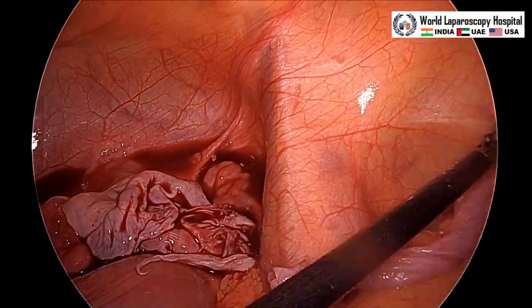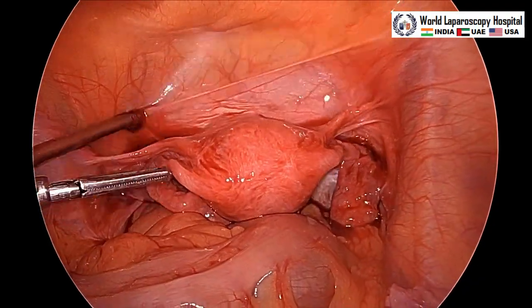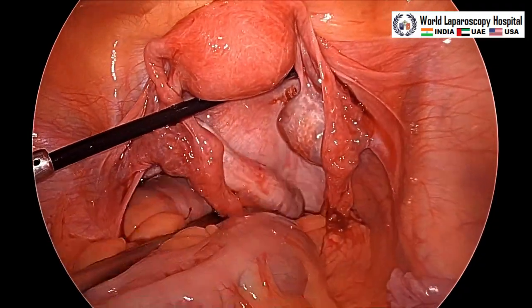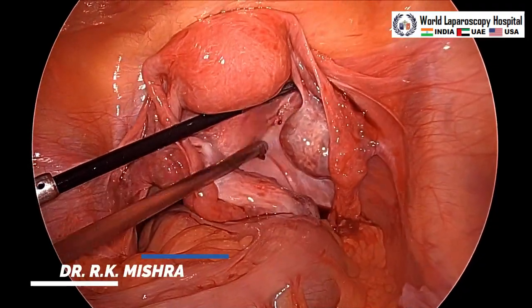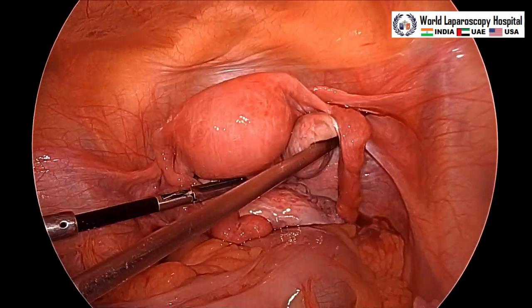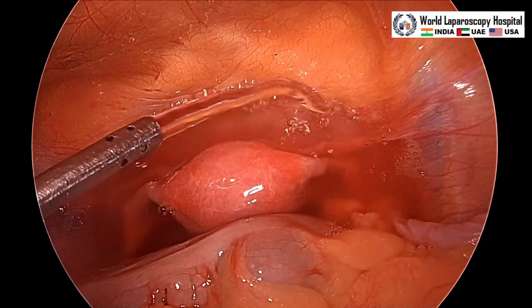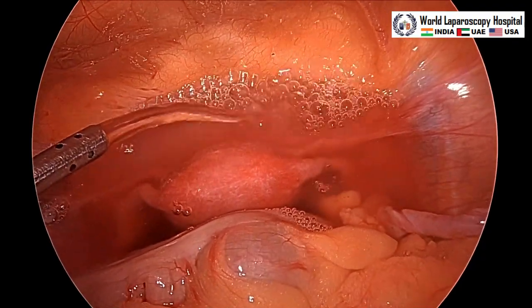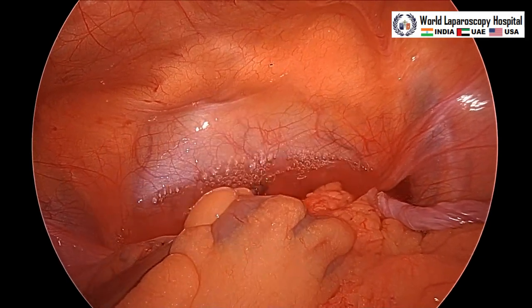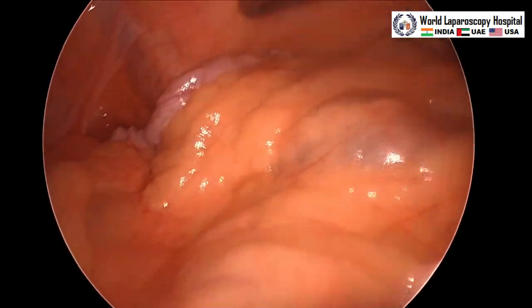You can disengage it and then suction irrigation will be carried out. Any oozing or bleeding should be taken care of and you should inspect all around the pelvis to confirm no bleeding, then suction irrigation again will be performed and the cystic wall will be taken out. Just checking — you can see the fluid is clear, there is no bleeding; two or three times irrigation will be performed to check. If there is bleeding, you can take a bite and suture, or use bipolar for desiccation or monopolar for fulguration.